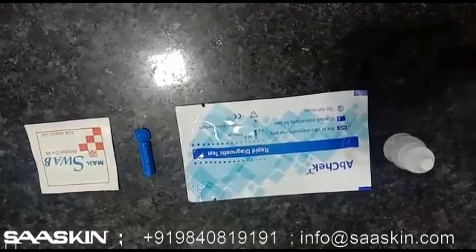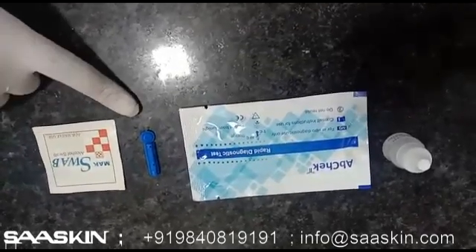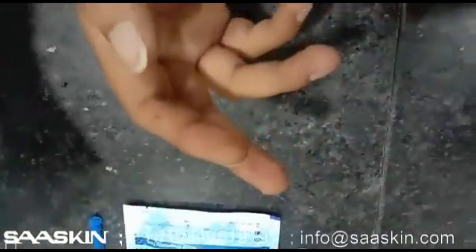For the abject COVID-19 IgG/IgM antibody rapid test kit, we require an alcohol swab, one lancet, one cassette, and assay buffer. Wipe the finger with the help of the alcohol swab.